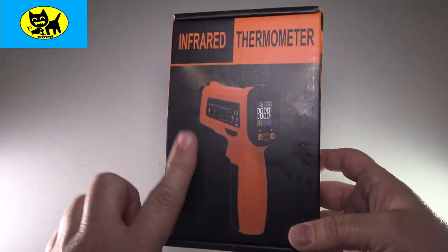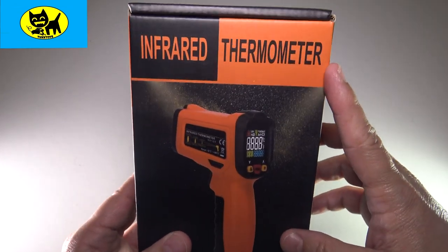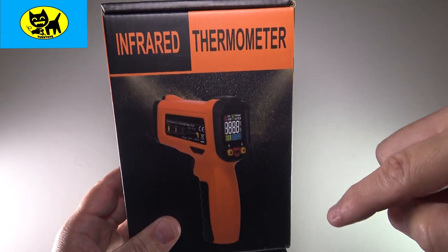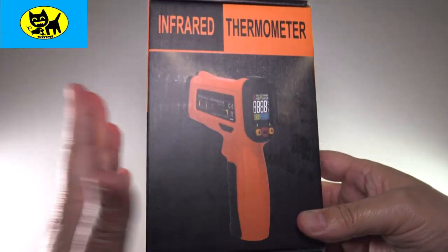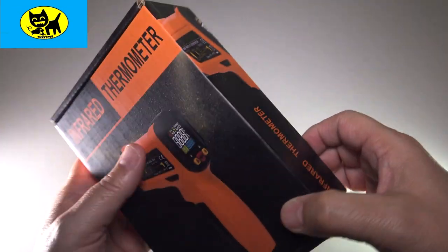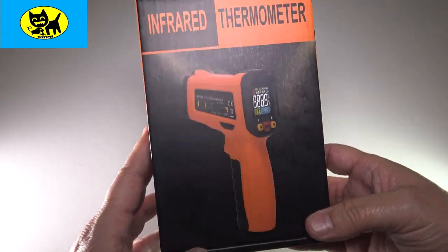So this is really great. It's available on Amazon and I will have a link for you for the very best price right down below. Click that link and protect yourself and your family with this great device. Let's go ahead and unbox it — this is how it comes from Amazon. Really cool package; the black and orange looks really good.